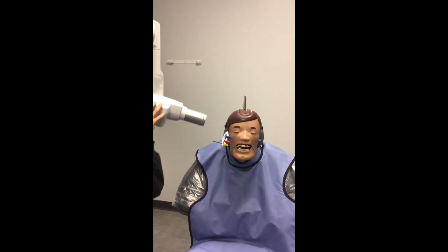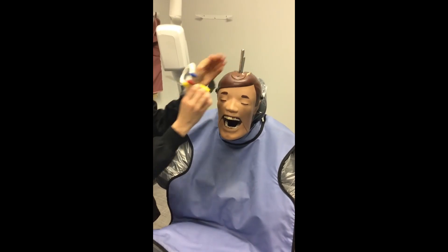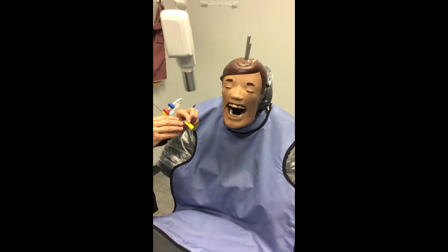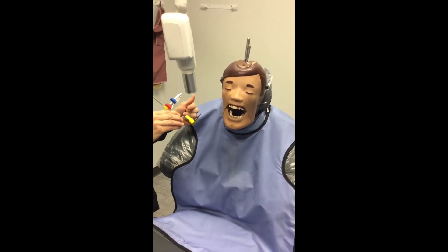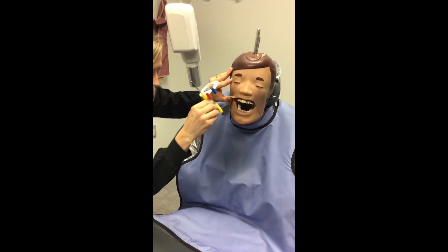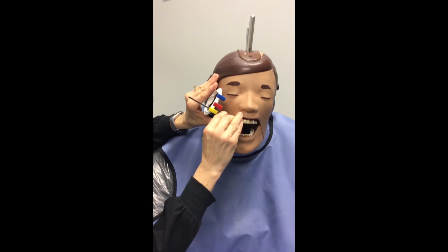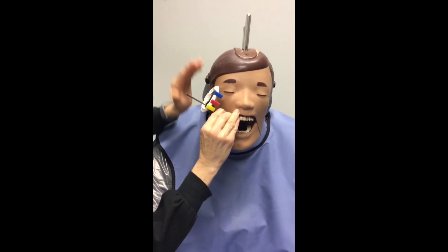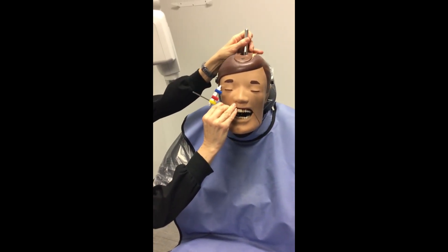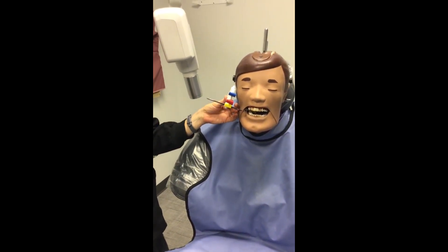After taking the premolar projection, get another PSP plate and do your molar projection. Just like with bite wings, you want the distal half of the second premolar. Pull your patient's cheek back, identify where the second premolar is, and look at the front of your packet to make sure it's halfway at that premolar. Your bite block should be on the teeth you're taking, your sensor angled toward the central incisors, and then have your patient bite down. Line up your tube head just as we've discussed.